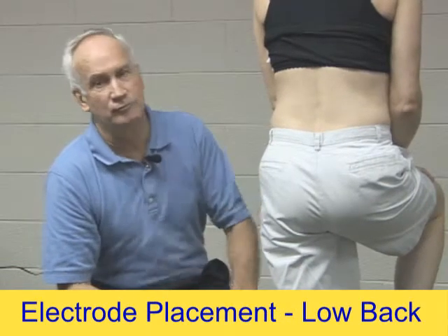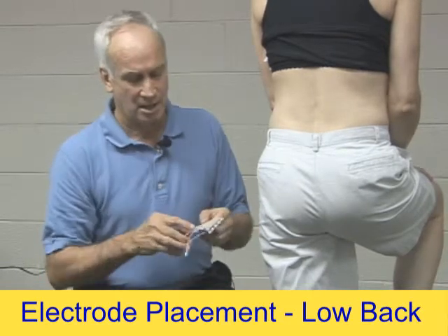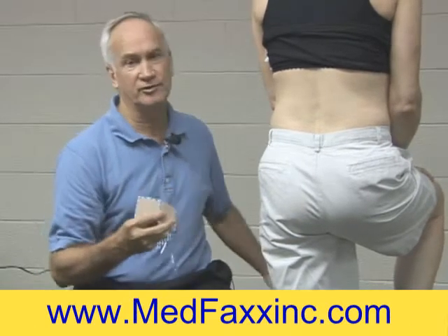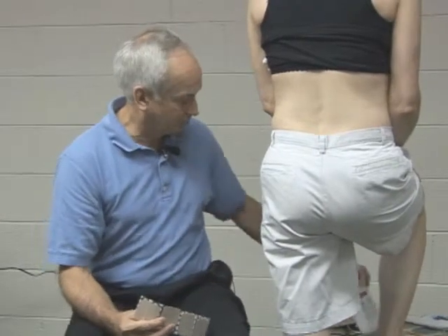Hi, today I'm going to show you a little bit about electrode placement for chronic low back pain. One of the things I want to tell you right off the bat: with the Infrex Plus, the unit itself has TENS and it has interferential. Always use interferential mode first — that's just a general rule for what you use on the Infrex Plus.